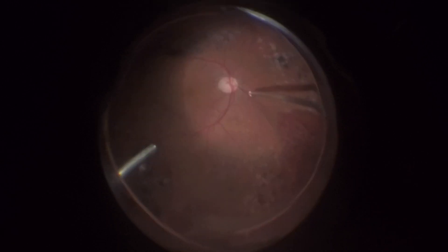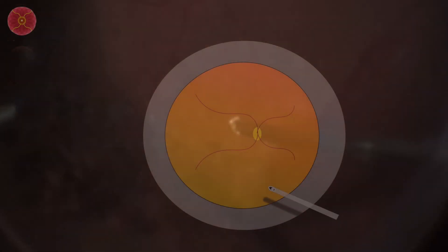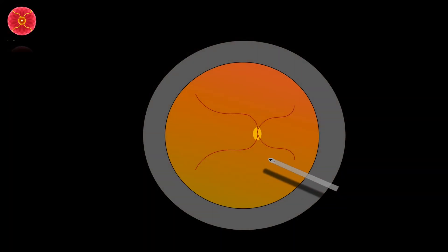A good parameter to improve the notion of depth during maneuvers in which we have to get very close to the retina is to pay attention to the shadow of the instrument. Note that the closer you are to the retina, the shorter the distance between the tip of your instrument and its shadow.